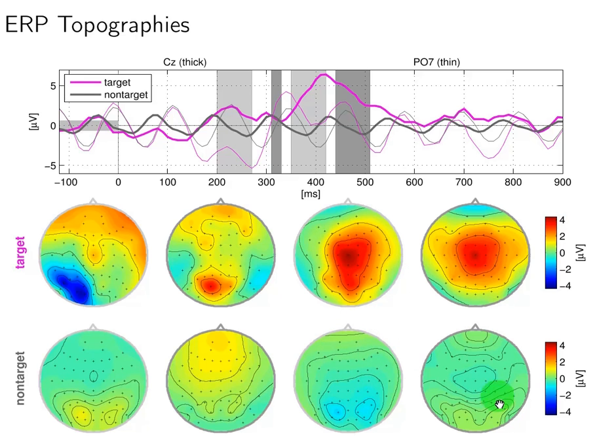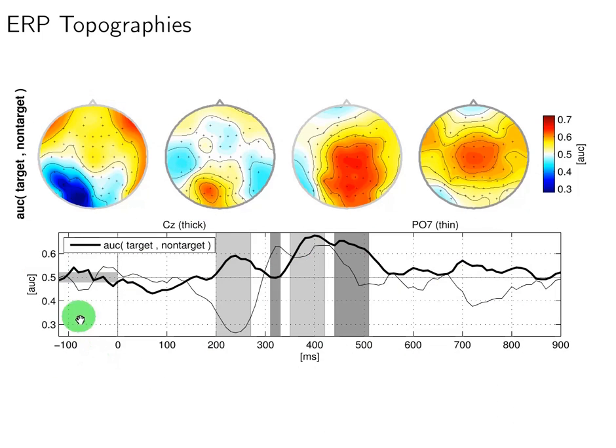This kind of visualization helps us focus on the part of the data that contains discriminable features, if we are interested in classification or improving the classification of the BCI. We can also visualize this topography using different features or representations of the ERP target and non-target.